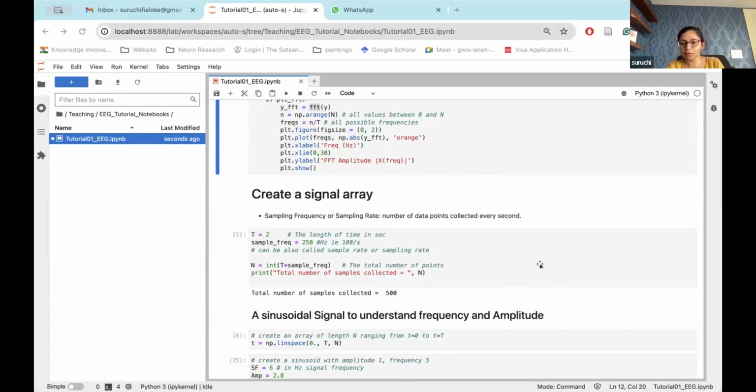Okay, and here in the real world, everything will be changing. It will be a mixture where we can change amplitude, frequency, and phase. All of these things will be changing, and your brain would be generating things at different frequencies, different amplitudes, different phases. So we do analysis to decompose them into their right constituents and look at those plots.